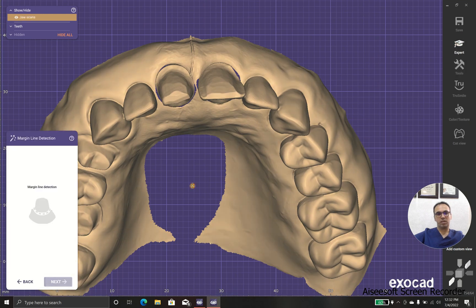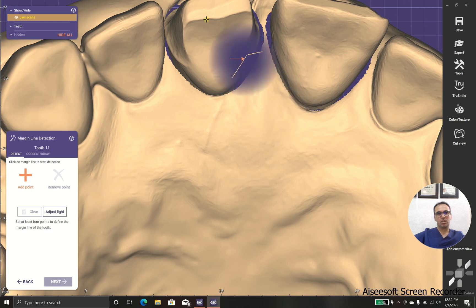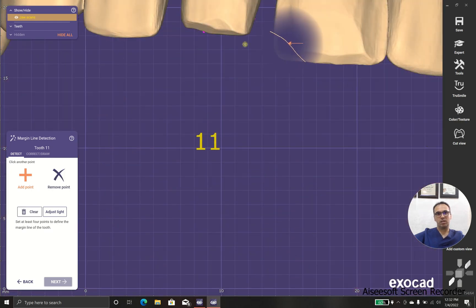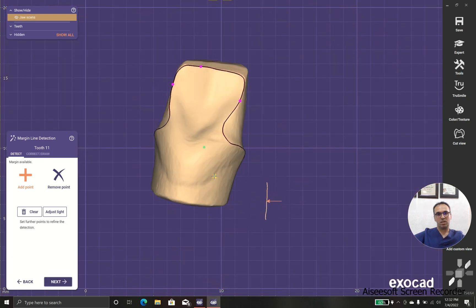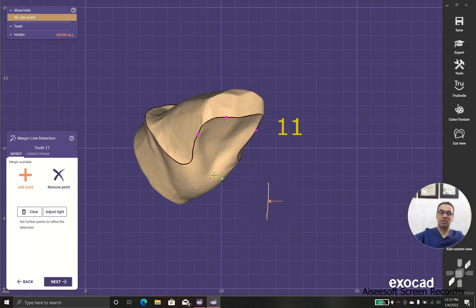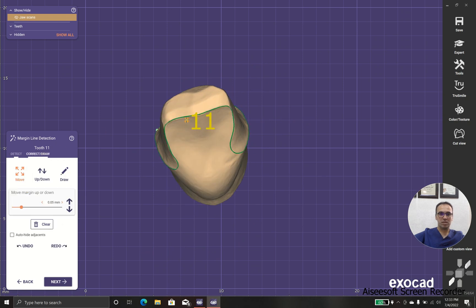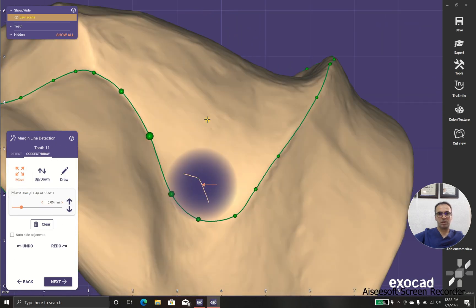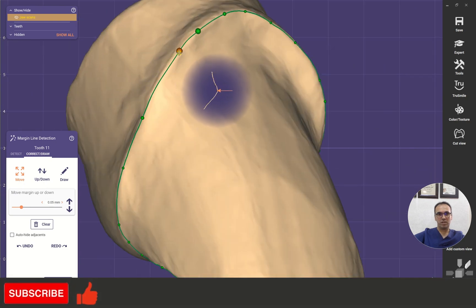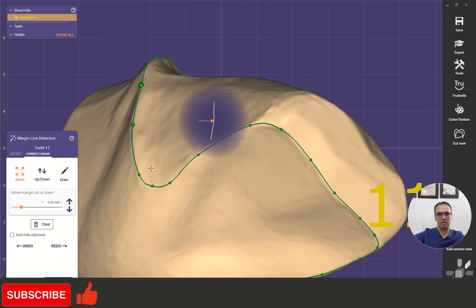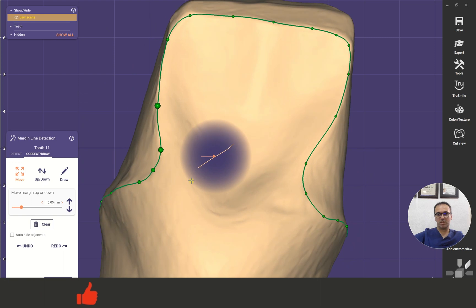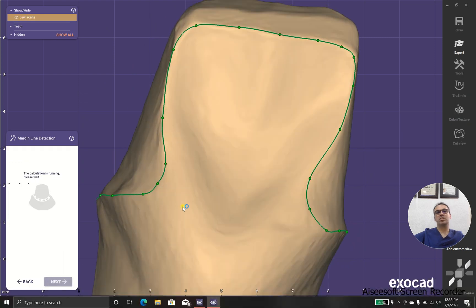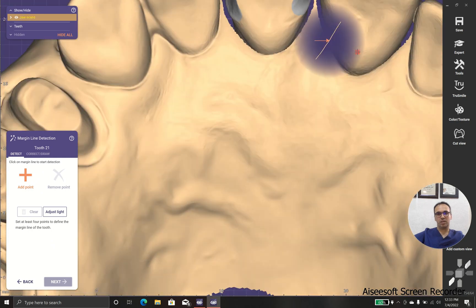So I'm getting back to the margin detection, and I'm going with detect. Let's see whether it works. Yeah, it could understand where it should be, and as you can see, the margins are perfectly detected by the artificial intelligence of the software, and there's almost no correction. Yeah, I'm so happy with this margin detection.